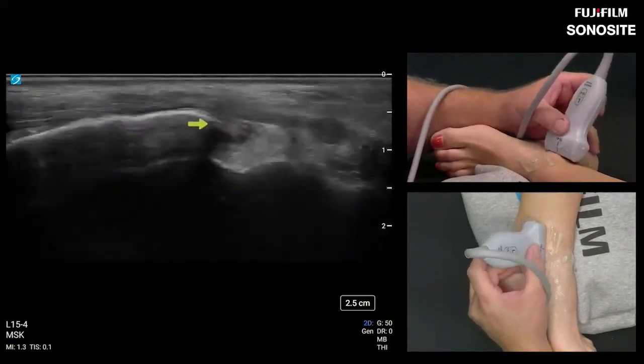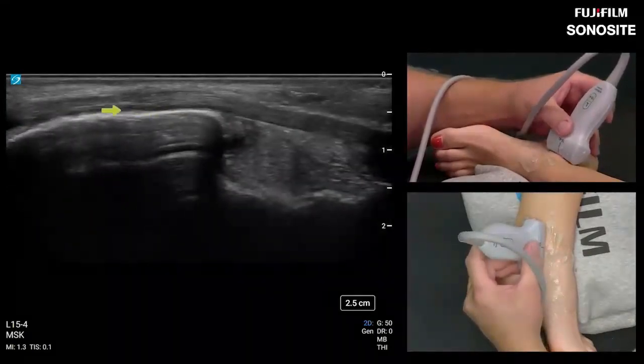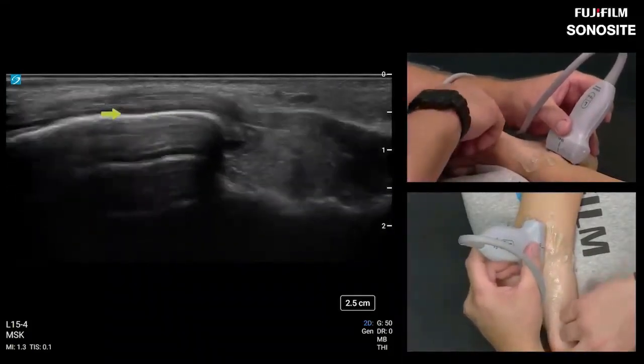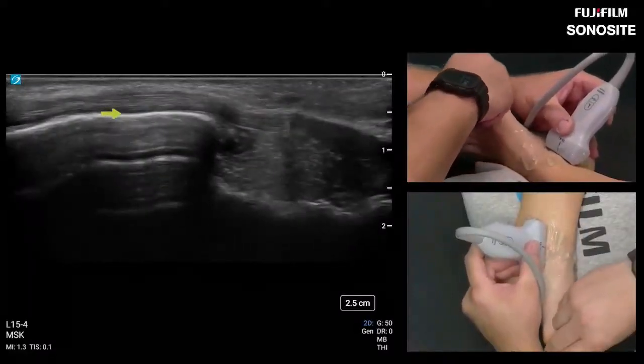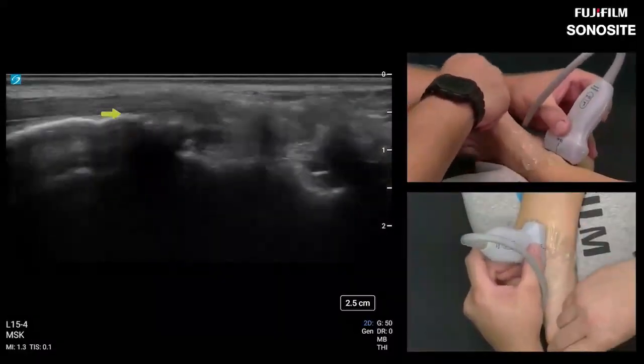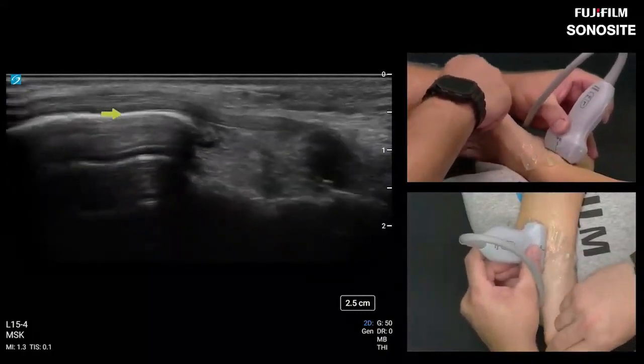But let's scan this tibialis posterior here. If we wanted to move it, that'd be inversion. Getting the navicular to move, basically. So you can see the tendon on the far right side of the screen tenting up as it is less taut.